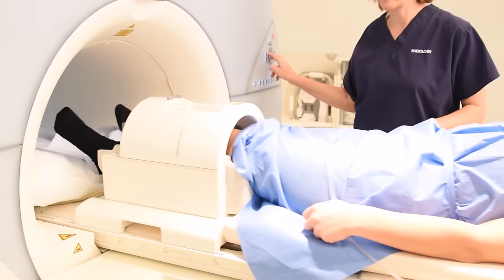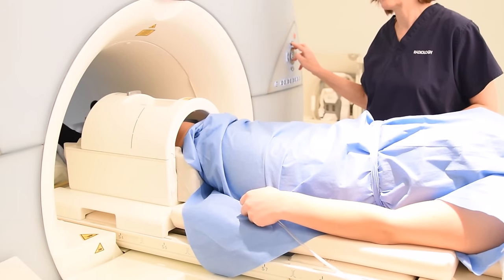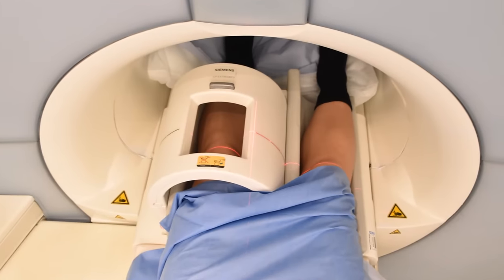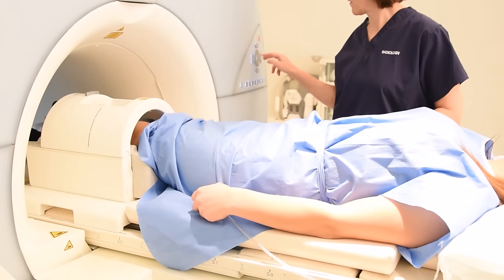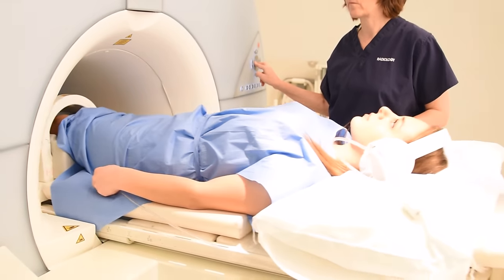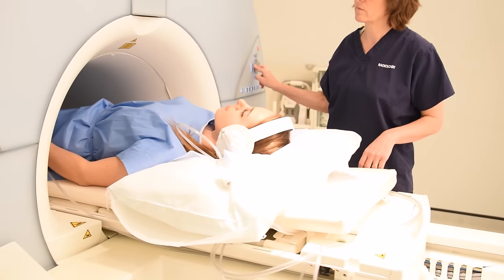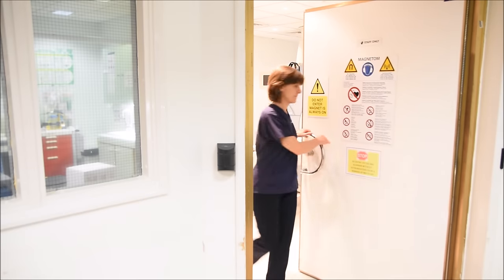Move the table and centre the laser beam localiser over the lower border of the patella. Move the patient into the scanner, making sure they are calm and comfortable before you leave the room.